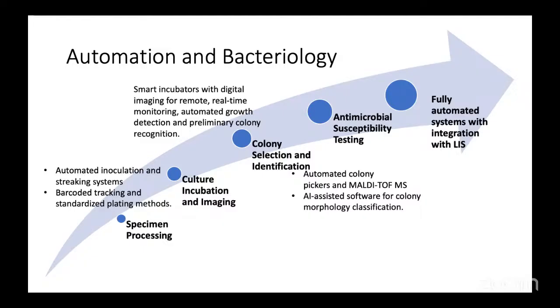Is it possible that I read them in real time, just like we have real-time PCR, which has completely changed the game of molecular testing? Do we have real-time monitoring where we can say that because the colony count was so high, this colony has already grown in 5 hours or 6 hours or 12 hours rather than 18 hours? Am I able to release that report before 18 hours?